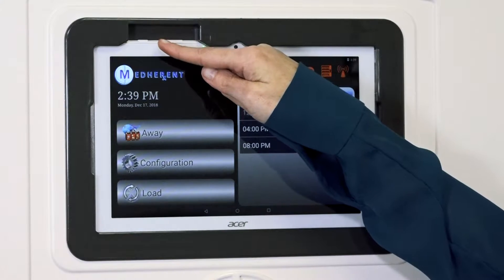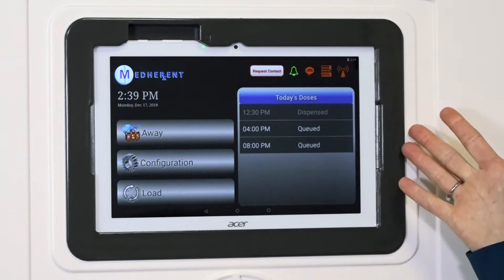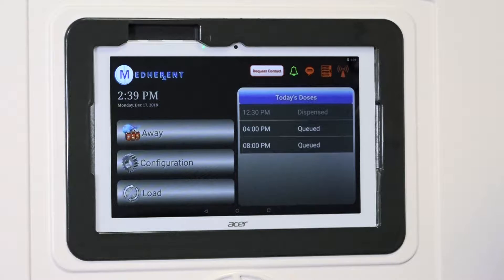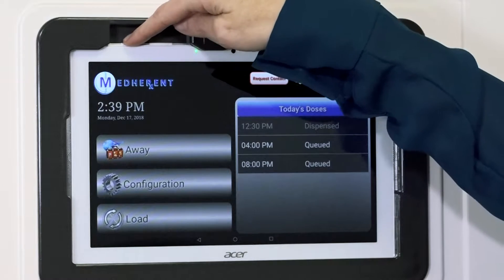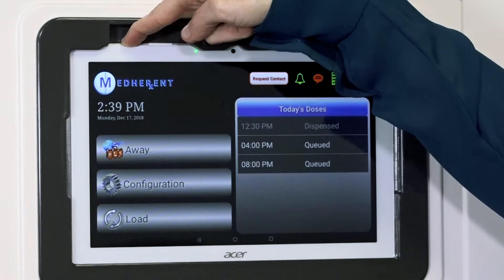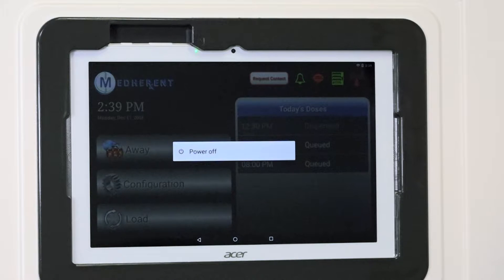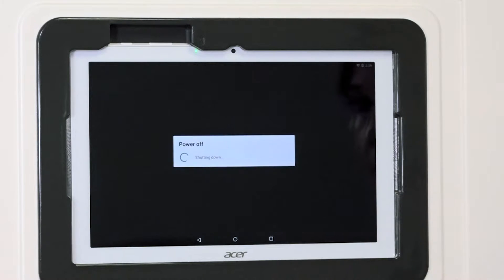This is the power button for the screen that effectively controls the Medherent device. Please do not push this button unless told to do so by members of the Terrapin Pharmacy team. If, however, you are instructed to turn the power off by Terrapin, then please make sure that you hold the power button down until a pop-up appears on the screen that says 'power off.' Tap this pop-up message to confirm that you want to turn the screen off. The screen should now read 'shutting down.'